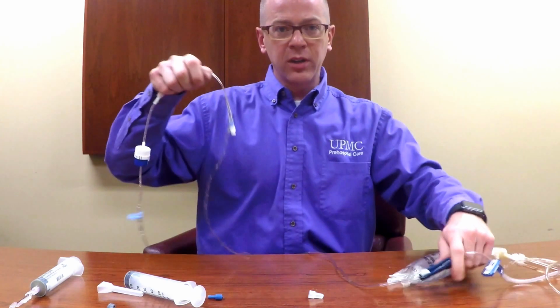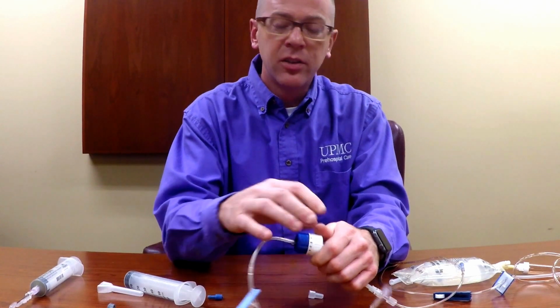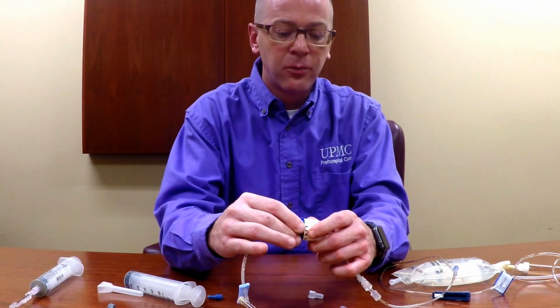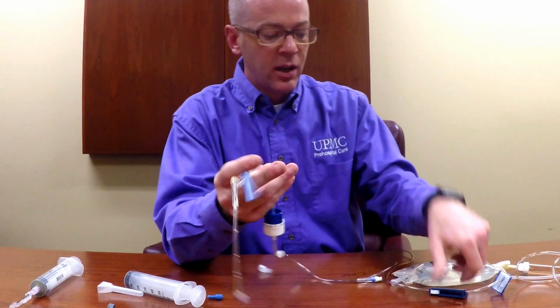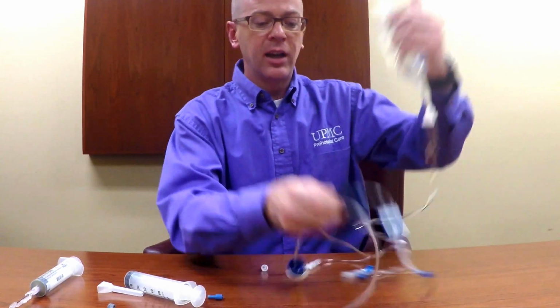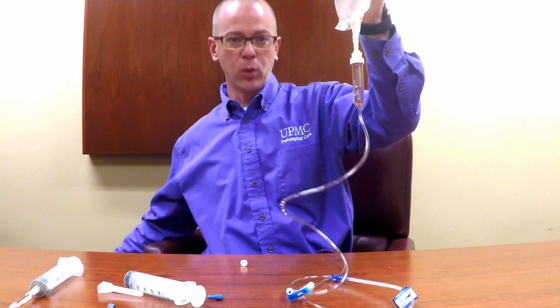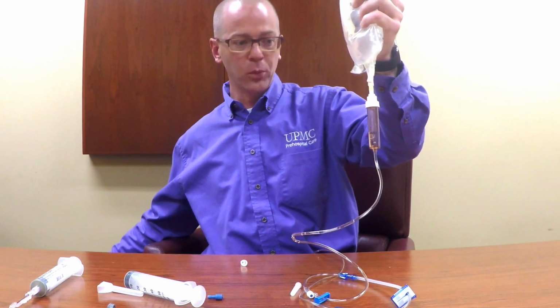Once I see that my tubing is appropriately primed, I can go ahead and set my drops per minute to the appropriate dose based on the dosing chart provided as reference. So for example, if that was 40 drops per minute, I line this dial up to the 40, and I go ahead and connect my fluid to the patient. I hang my bag up high, and as I turn this administration set on, you'll notice that the micro drip set is regulated to administer 40 drops per minute. I can dial that up and down to whatever titrated dose is appropriate for that patient.